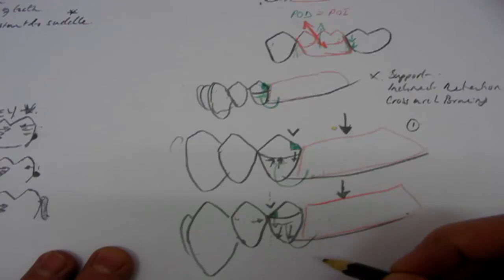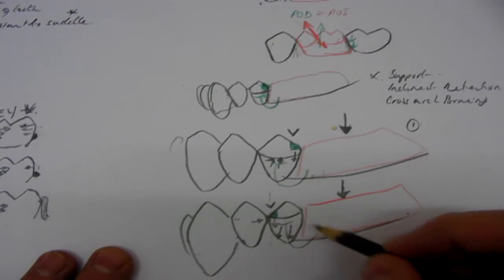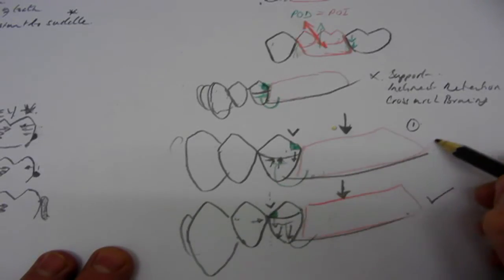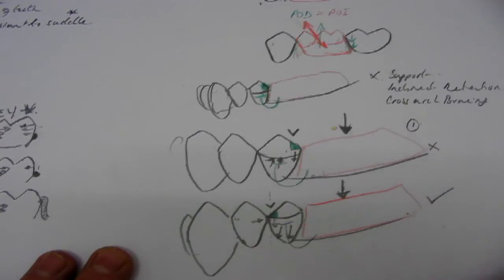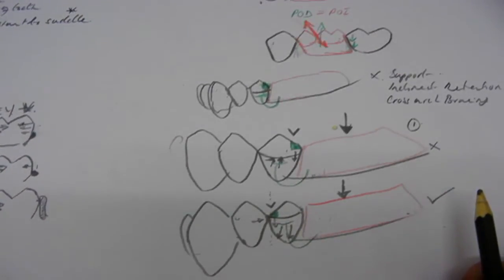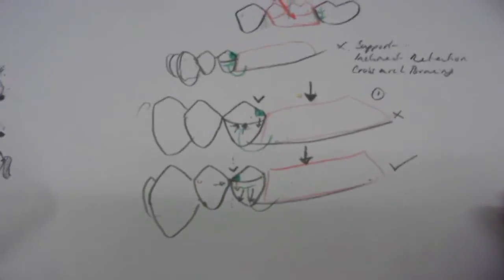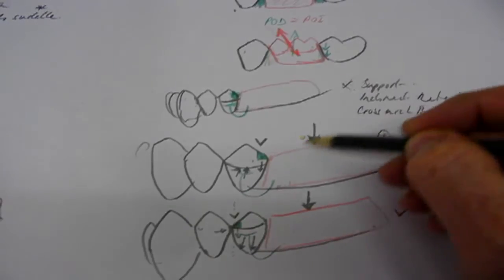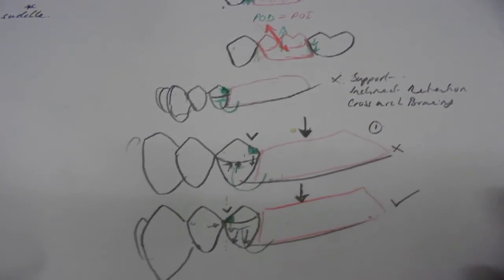So it's going to disengage from the tooth, and thereby it won't cause any damage. So this is considered good. Distal occlusal rest, poor. Okay, and that's to improve the support or protect the teeth when you're loading the free end saddle. So that's number one on our list of why we move the occlusal rest to the mesial side of the tooth. So let's go over the page.